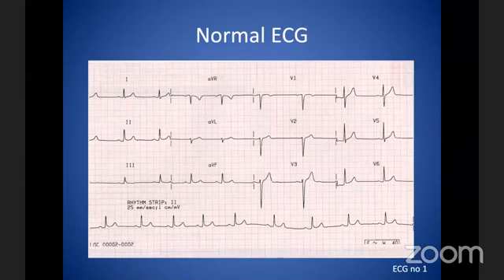Now, stay mute, all of you, please. So the purpose of this ECG, it already tells you on the top it's a normal ECG. But I want to take you through a scheme of how you should report it.